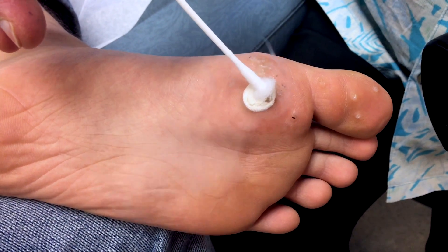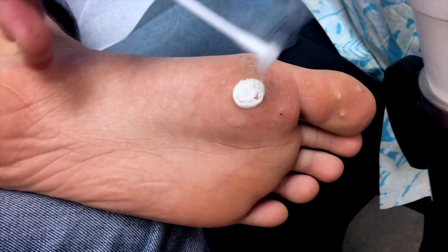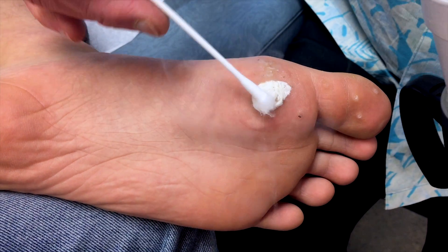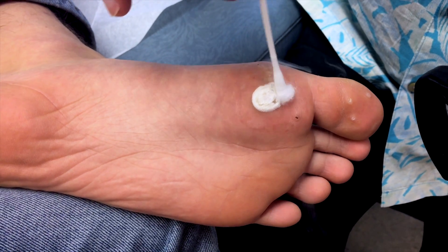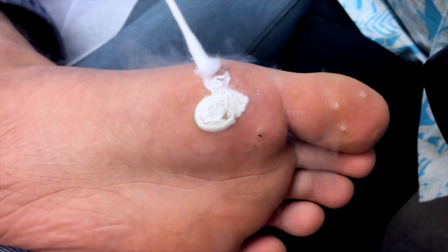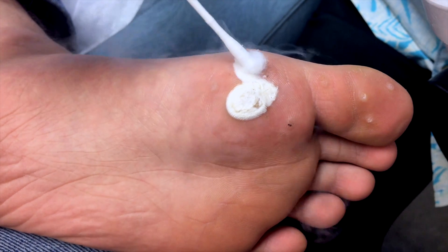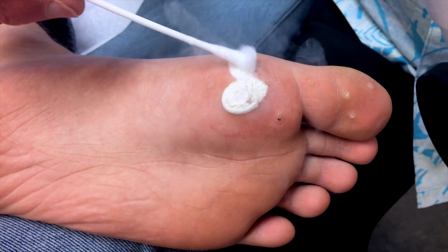And when the tears start rolling down, he's like, 'Doc, you are mean.' Oh gosh. This one is just so deep, that's why it's kind of hard. But what this actually does is it activates your immune system. So when we get blood flowing to this area, your immune system actually starts interacting with the virus. It's a sizzle. Yeah, I hear that. It's kind of like snap, crackle, pop — Rice Krispies. Yeah, that is true.